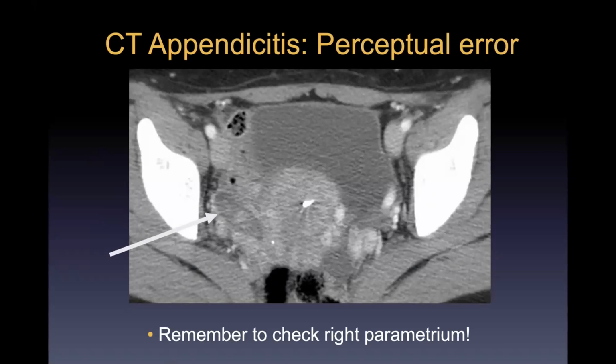And I have looked back at all of our cases of missed appendicitis over the years at UCSF, and I feel like virtually always, when we miss an appendicitis, it is this exact scenario where it is a young woman and the appendix is sitting in the right adnexa.